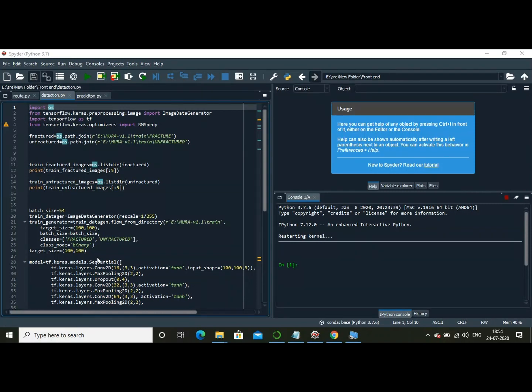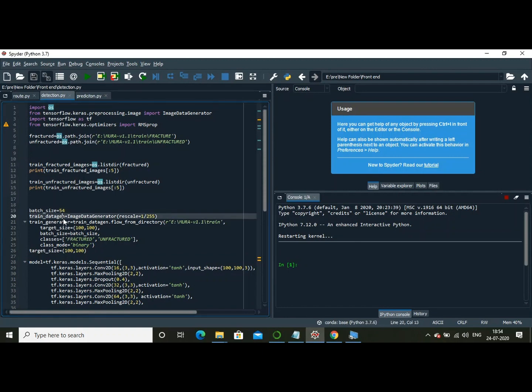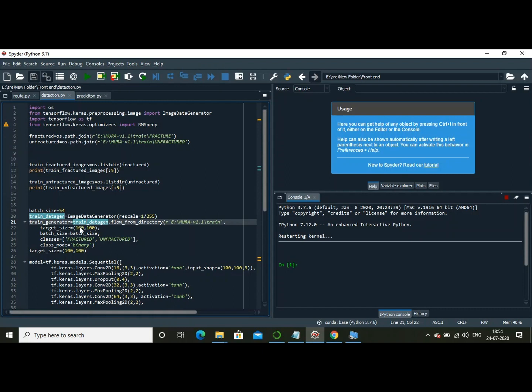First of all, you're able to see here that I am training the dataset to the algorithm. This dataset is also called the MURA version 1.1 dataset. I'm taking the target size as 100 by 100. The batch size is 54, which means that per batch I'm going to take 54 images in order to train the algorithm.